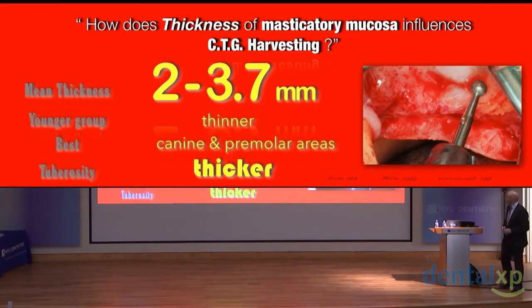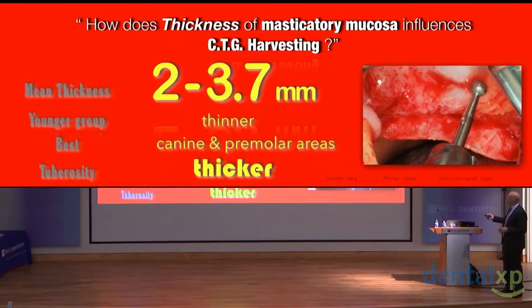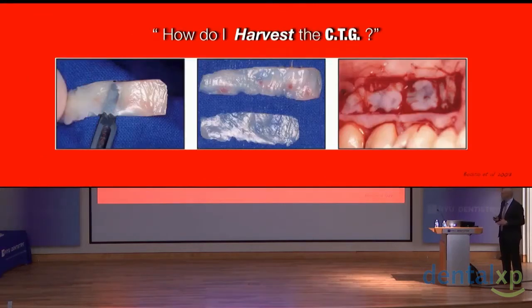What is important is to know how much tissue do we have in the palate. I have around 2-4 millimeters of soft tissue thickness. So most of the time, I have enough tissue to take a connective tissue graft. Of course, I have more tissue in the tuberosity.